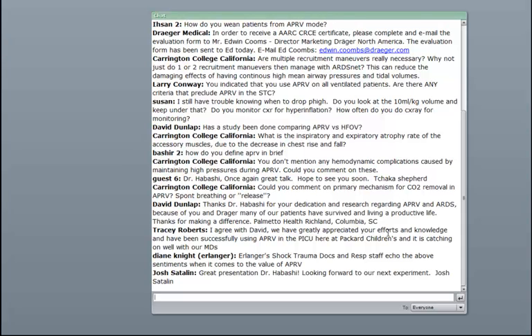Once you release the airway pressure, what you're doing is convectively moving the CO2, so you are probably having a higher CO2 per volume content. Again, if you look back at the volumetric CO2, you tend to see that. So you can certainly see an increased efficiency. Generally, our minute ventilation is much lower than conventional ventilation. In fact, the earlier study suggested a 30% reduction in minute ventilation over conventional settings.